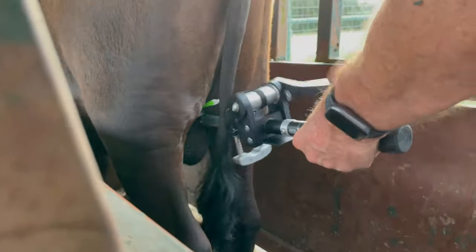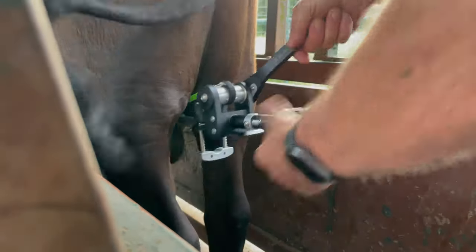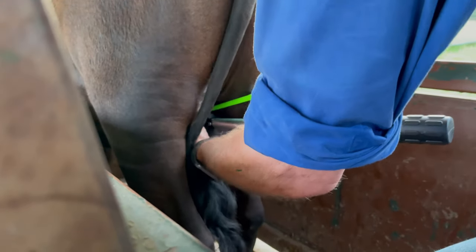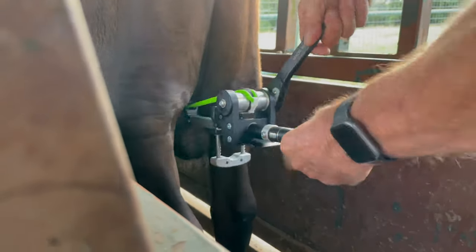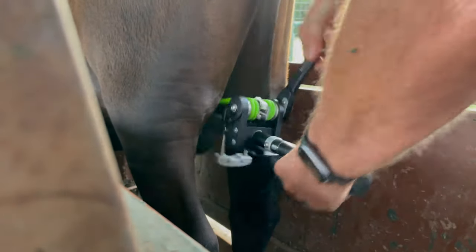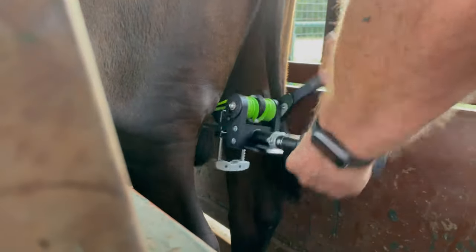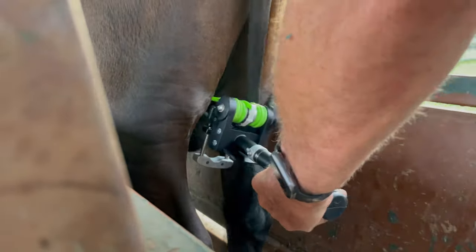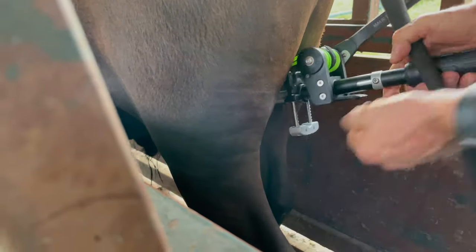I had a little technical difficulty there. I'm watching this right here and making sure both testicles are in there. Watch the tensioning as that slide mechanism draws down. I'm right there — going to go one more click. The cutter is down here, so I'm going to pop the cutter and I'm done.